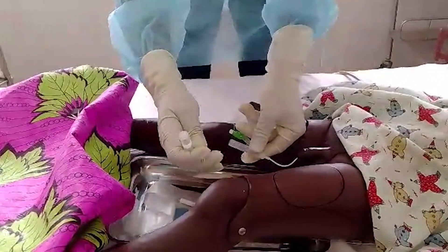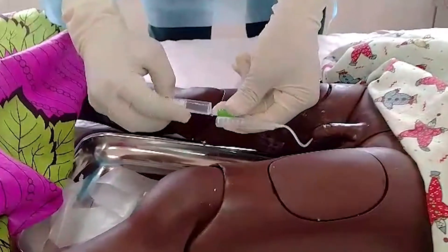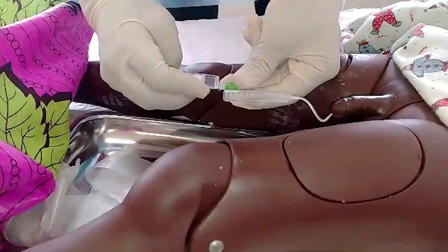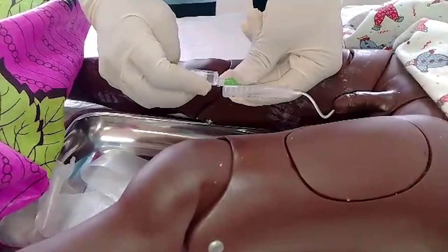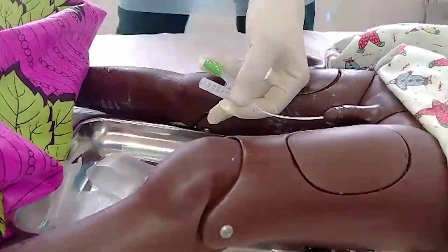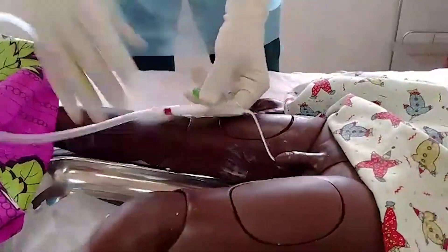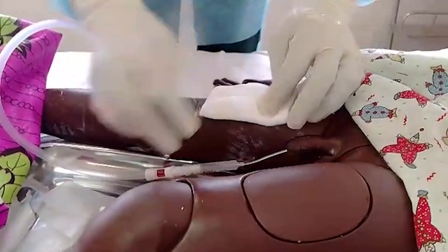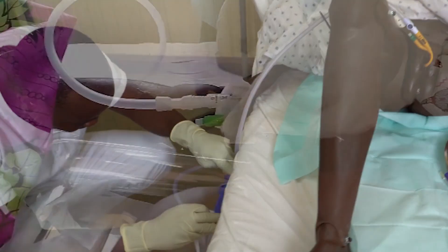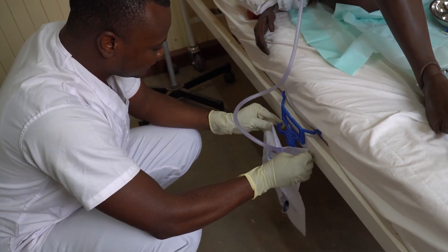For both male and female patients, if the catheter is to be indwelling, once the urine has flowed and the catheter has been advanced, inflate the balloon using a non-touch technique with the recommended amount of sterile water for injection. Withdraw the catheter slightly and use the non-touch technique to connect the drainage bag to the catheter. Secure the catheter in place by taping it to the patient's inner thigh or by using a securing device. Hang the catheter bag below the level of the patient's bladder with a fixation hook.